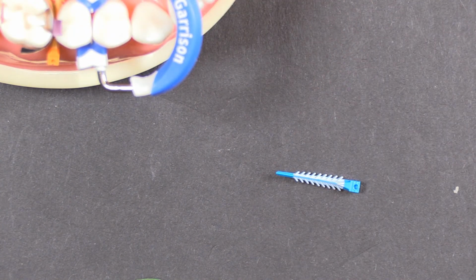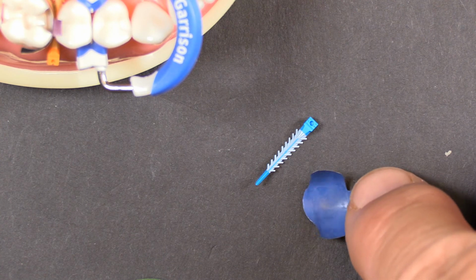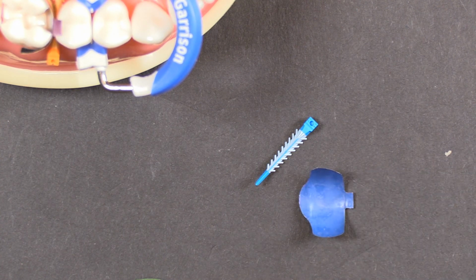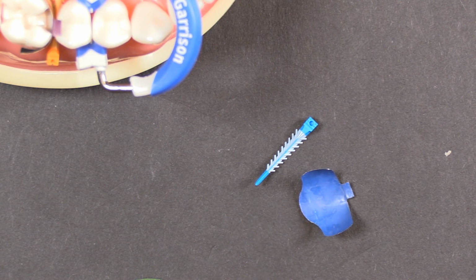Which leads us to another tricky question. How deep is too deep to restore? Again, I spoke with Dr. Braun about this. Of course, we make sectional matrix bands that are designed to deal with what I would call slightly subgingival restorations. Your challenge with those, of course, is going to be getting a seal of this subgingival tab against that root plane.